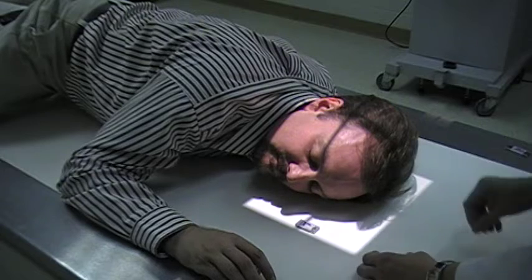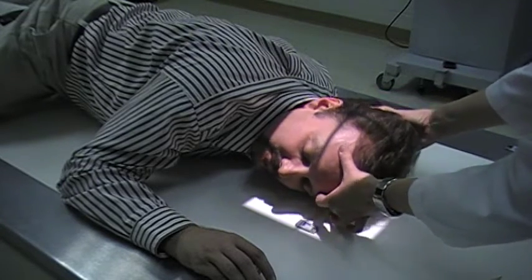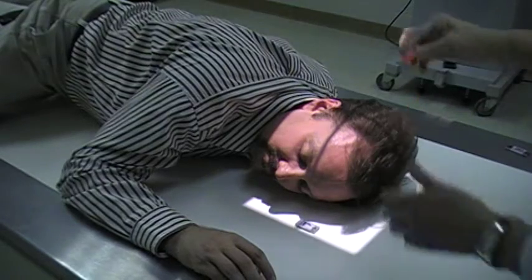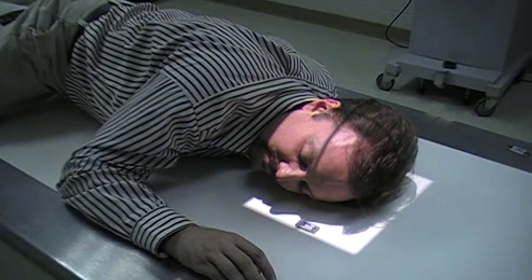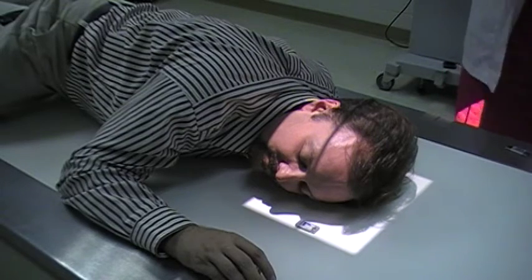And then also we want to check our infraorbital meatal line, and that it is going also parallel with the transverse surface. So we do have that, the infraorbital meatal line. So that is our left lateral skull. Alright, next we're going to do the PA skull.